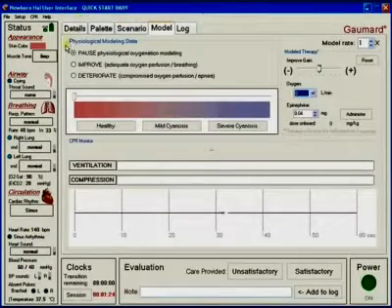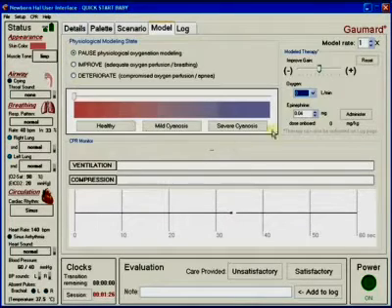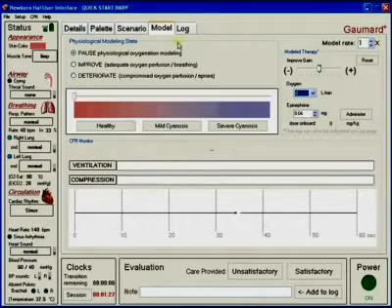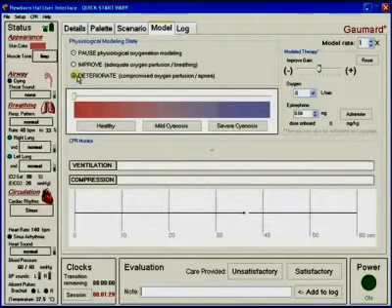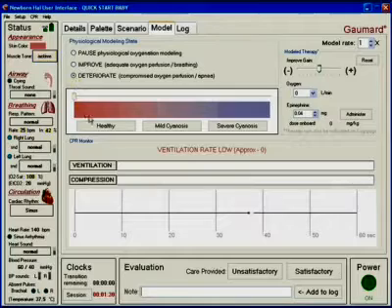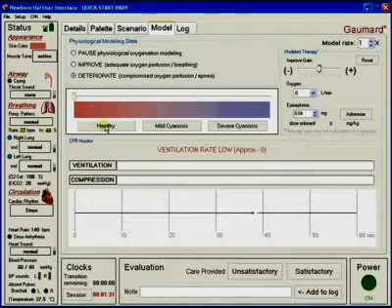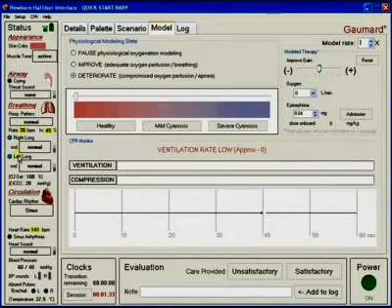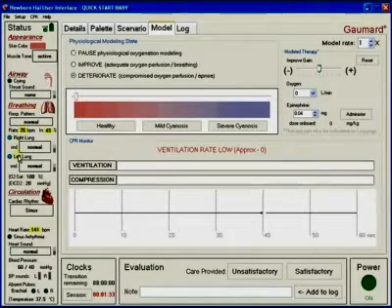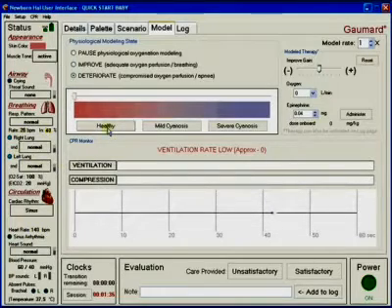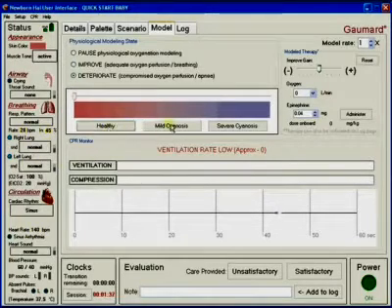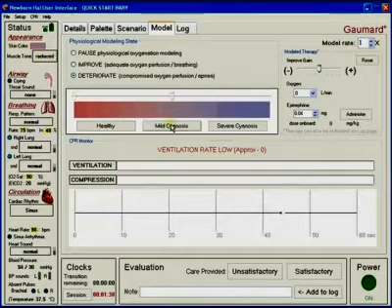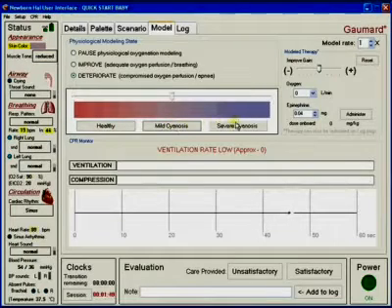The model tab contains a basic cyanosis model where the newborn HAL will experience deteriorating oxygen saturation due to a severe condition such as airway inflammation. The model can be initialized to anyone of healthy, mildly cyanotic or severely cyanotic states.